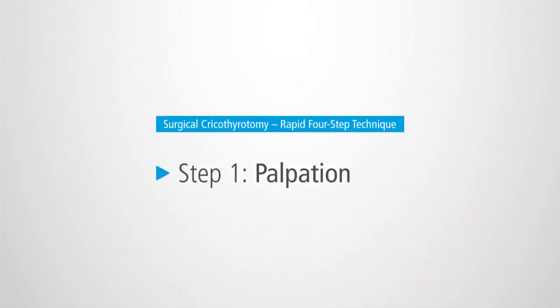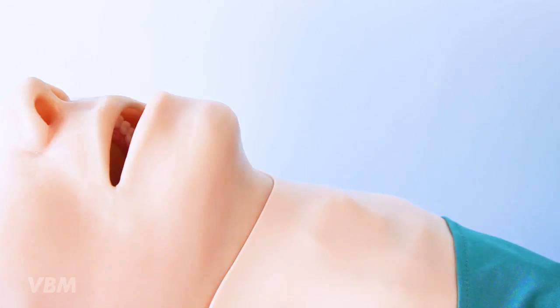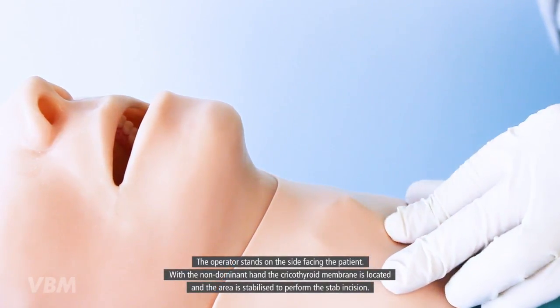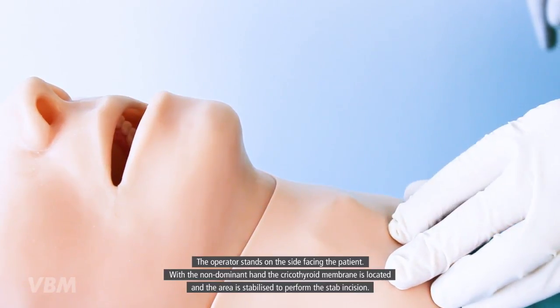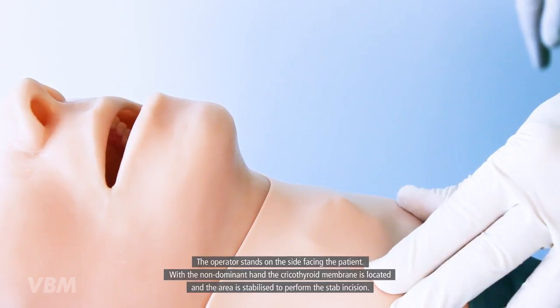The first step is essential for a successful outcome of the technique. The operator stands on the side facing the patient. With the non-dominant hand, the cricothyroid membrane is located and the area is stabilized to prepare for the stab incision.